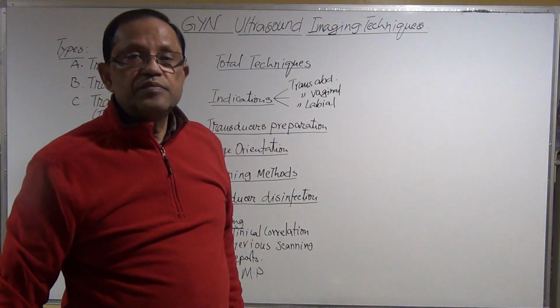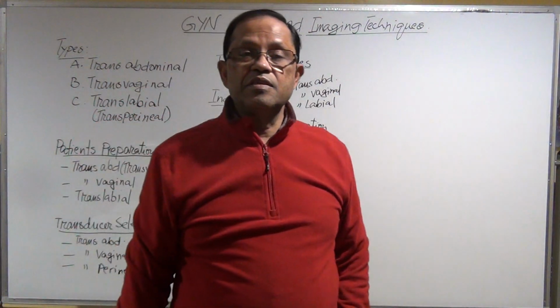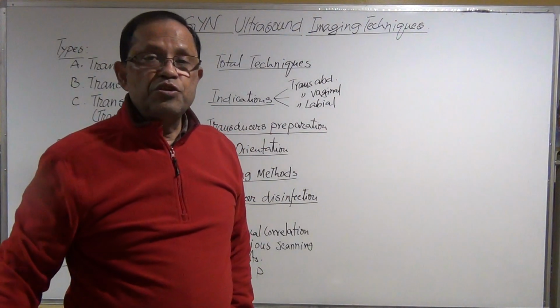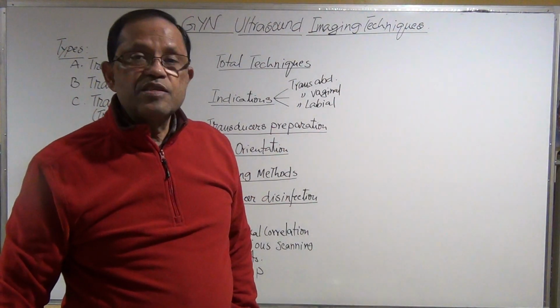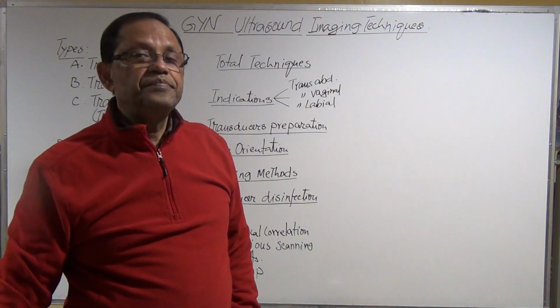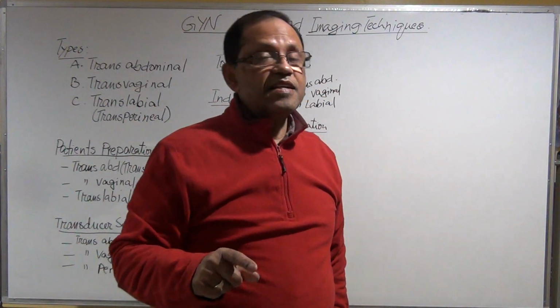Sometimes there is a pathology in the uterus that is obscured due to bowel gas. Some pathology in the fundus or in the cervix area is missed. And that patient needs transvaginal ultrasonography.